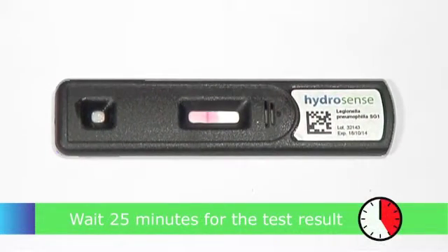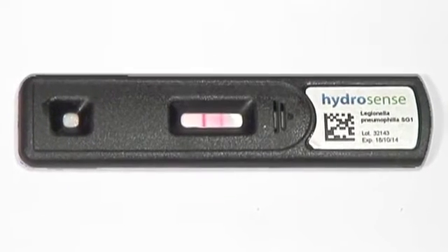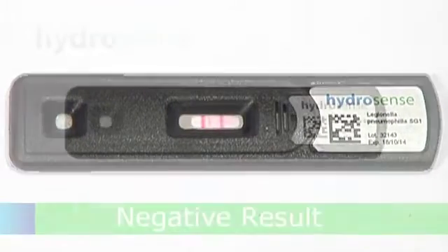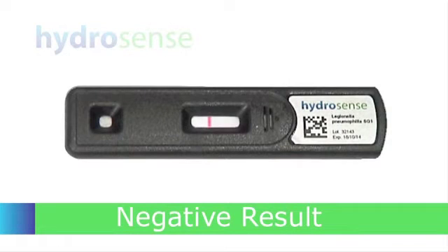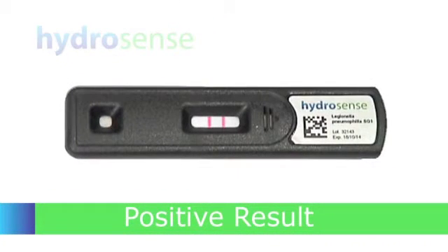The HydroSense strip will show either one or two red lines in the test window. A single line indicates a negative result. If the HydroSense test strip shows two lines, then this is a positive result.